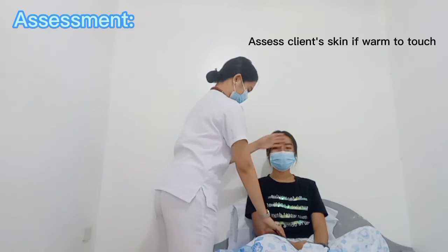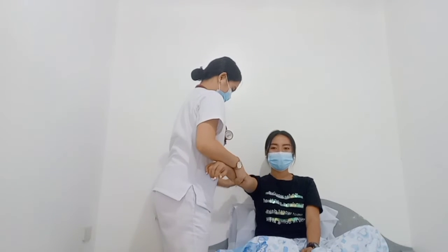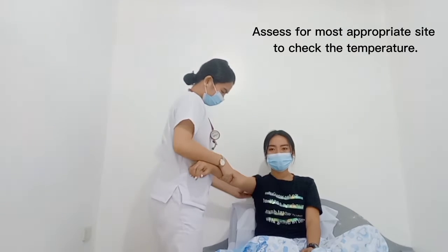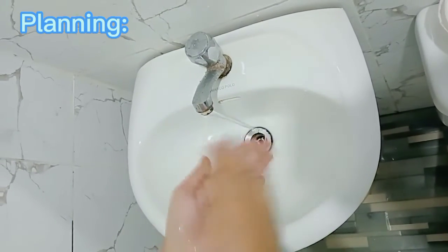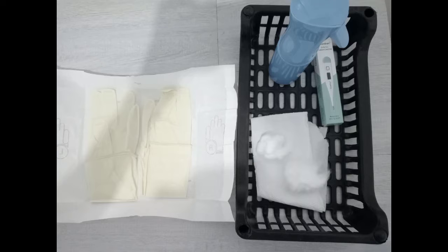For the assessment, assess if the client's skin is warm to touch. Assess for the most appropriate site to check the temperature. For planning, wash your hands to prevent the transmission of microorganisms, and gather all the equipment needed.